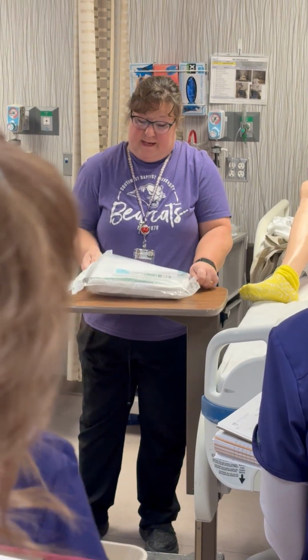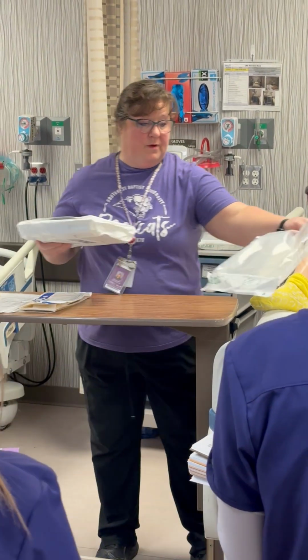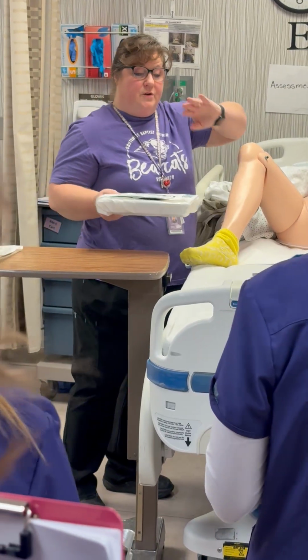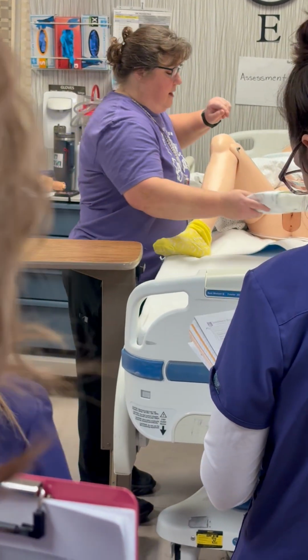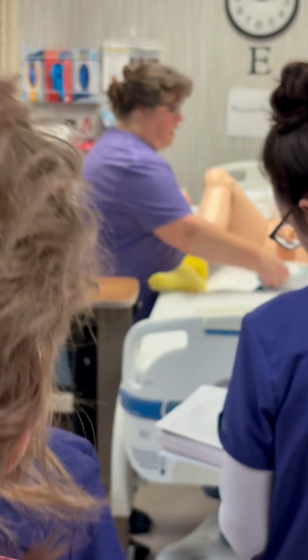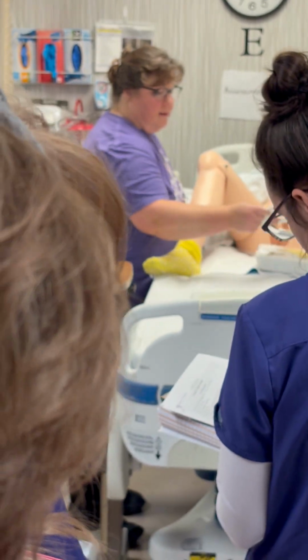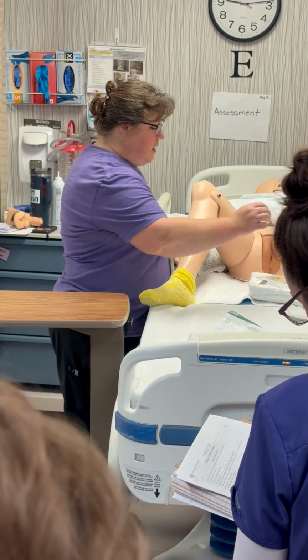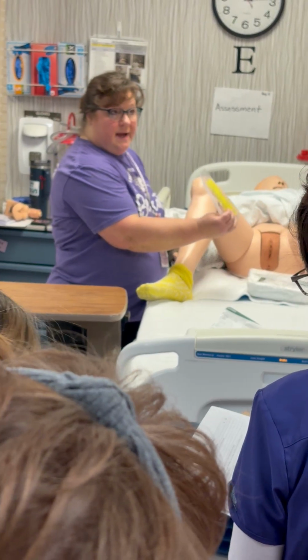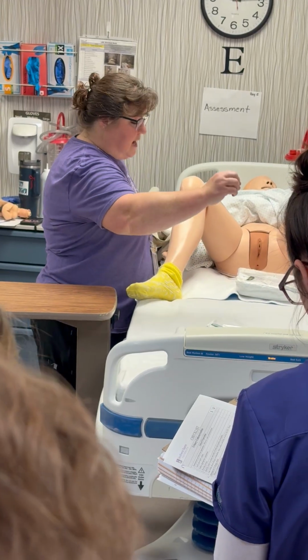So you open up this kit, put this at the end of the bed. That's where you're going to put all of your trash. And then I'm going to put this right between their legs, okay? And when this comes open like this, I don't need this part, it's trash. This is cleansing wipes. We already did pericare, okay? We already washed our hands, so we don't need this. It goes in the trash.